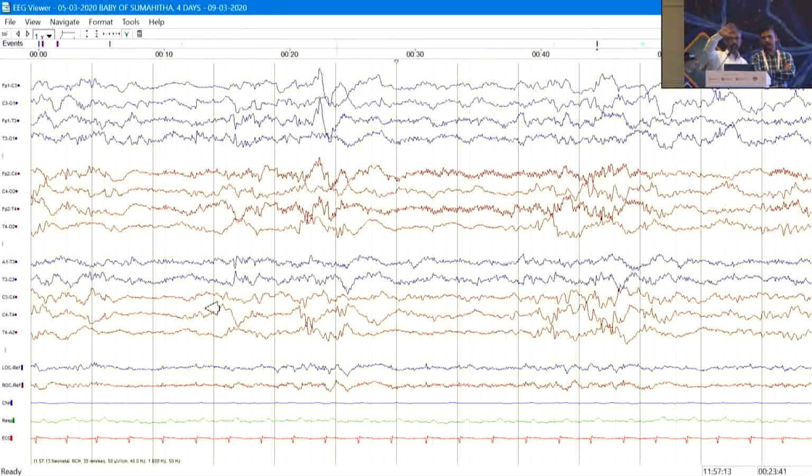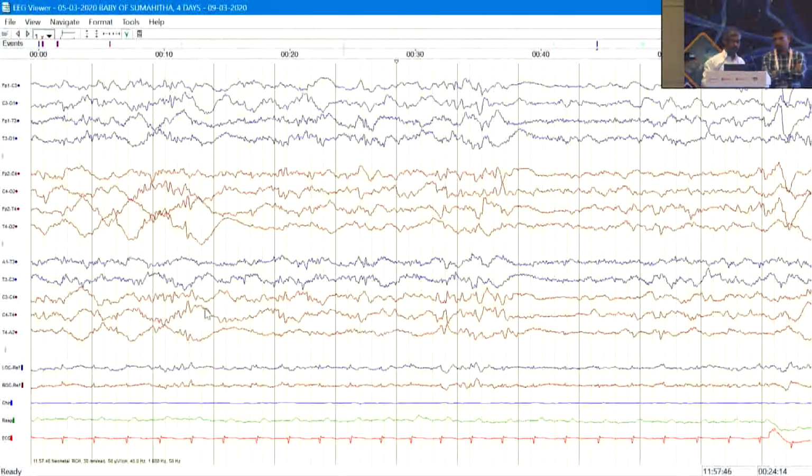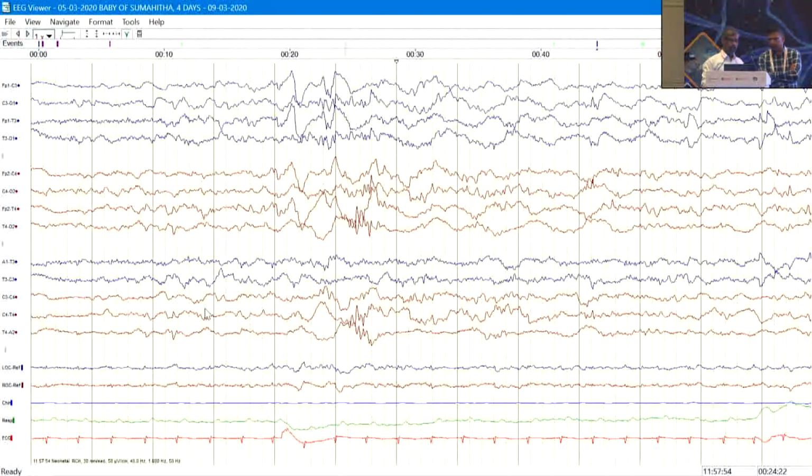So till now in these terminologies or in these newborn EEGs, any specific doubts? Anyone didn't understand anything? The newborn EEG is very difficult, and there are a lot of things. We try to simplify, we try to show you some of the salient points of what we can describe. If there are any specific questions, you can ask. We'll go to old age. Anything else?